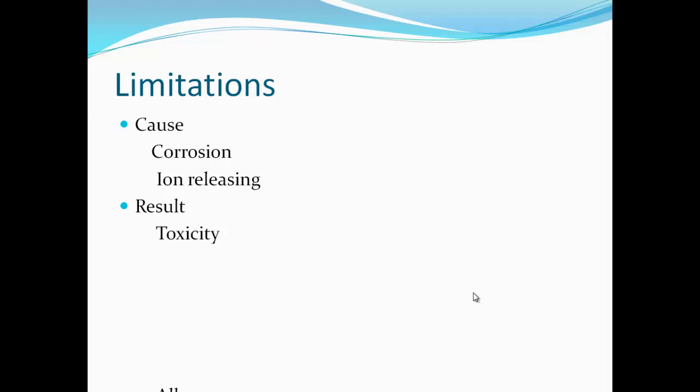However, it is still difficult to limit the allergic response caused by the releasing ion due to any corrosion of the stent. Most of the time, nickel is the most important ion that will cause the allergic response in the human body and will potentially cause cancer. As a result, different methods were applied and different materials were used to fabricate a proper stainless steel stent to prevent allergic response and toxicity of the material.